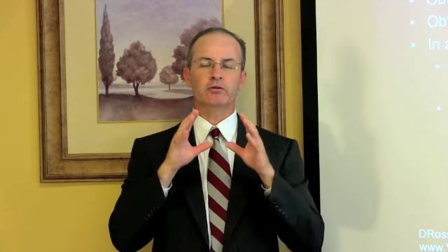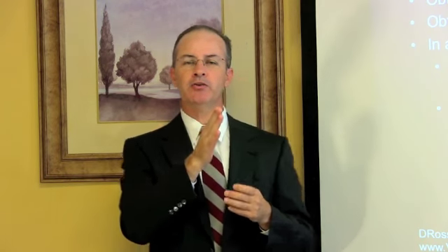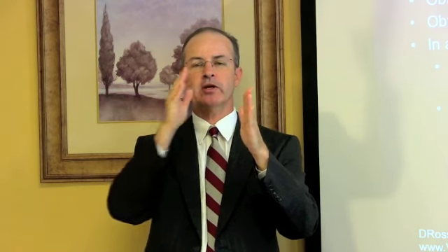Another point about the progressive atrophy is that not only does it show an objective sign of brain injury, but it places in time when the effect of brain injury occurred. And it places it after the time of the injury. In other words, we know there's atrophy occurring after the time of the injury. In the medical legal cases, it's often important to understand what caused the effects on brain structure or what caused the effects on the patient's symptoms.